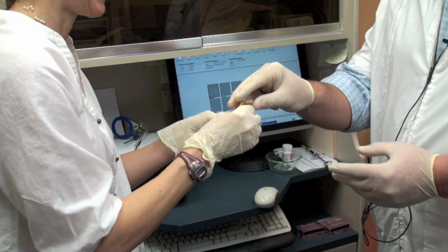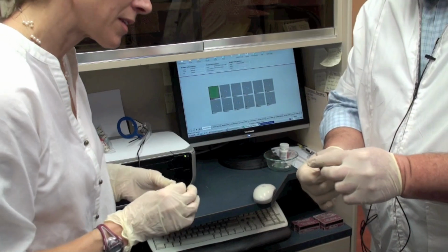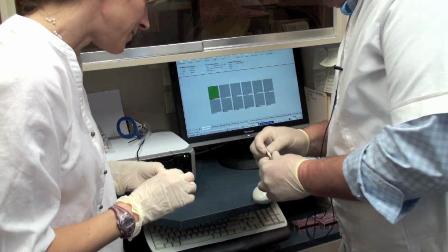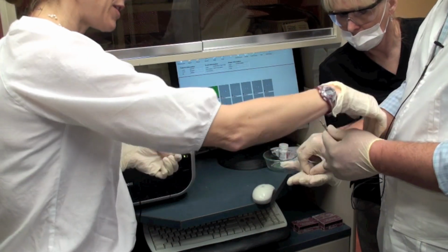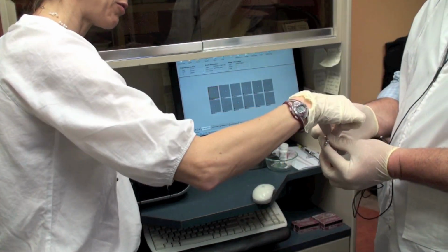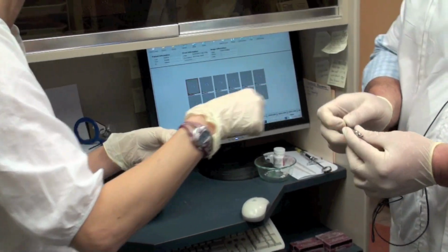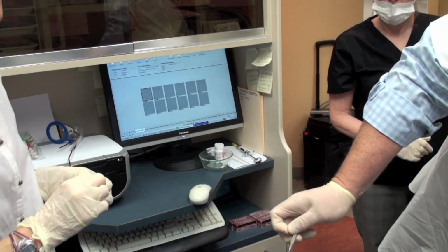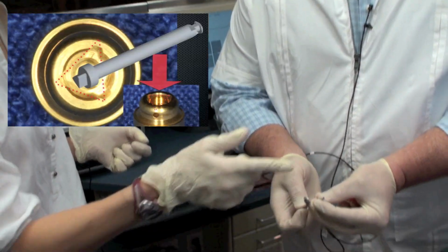Yeah. So the big thing is you have to turn it back the three turns, and then that gets rid of the middle part, because the middle part fits into the part of the locator. Do you have those, Sue? Did I need to order the attachment, which is good to have anyway, because this also removes the locators, right? But you also need the other torque. Yeah, this is just a quickie thing when you're playing with things. It's a good question. The best thing to do is to buy this little mandrel. That's what I did. I bought the mandrel that fits in.